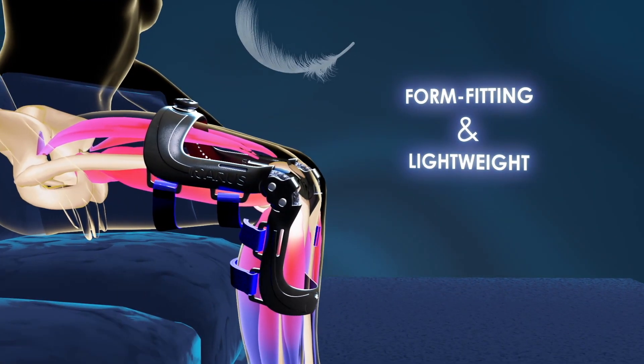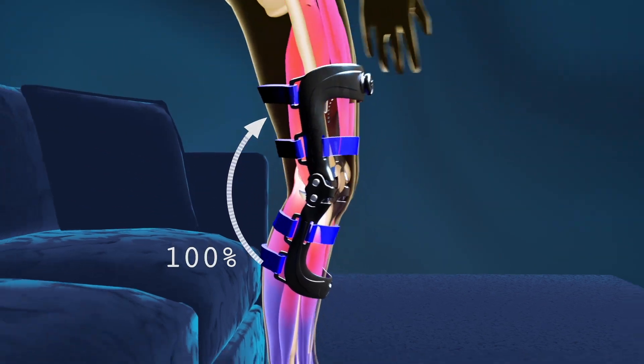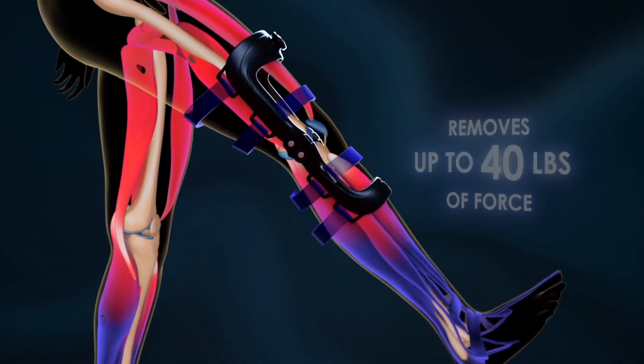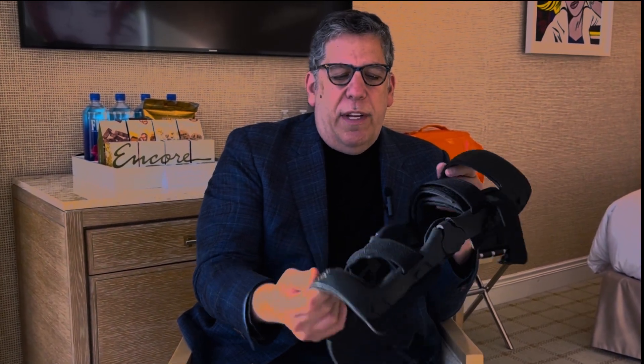The forces that the company's been able to show are quite remarkable actually. The amount of force reduction is greater than anything I've seen with any other brace in the patellofemoral region. There is no other brace that does what this does. We have plenty of patellofemoral braces, but they're mostly for stability and for compression, but none of them give this type of active assist and active unloading of that particular joint.